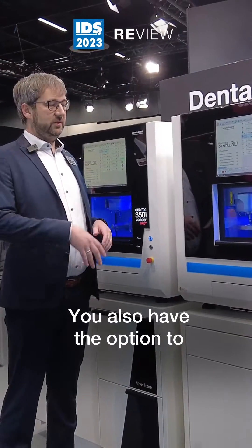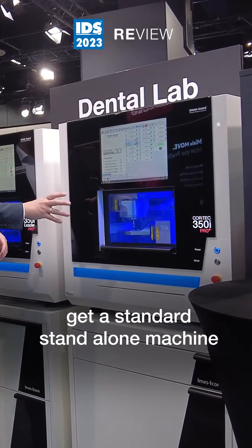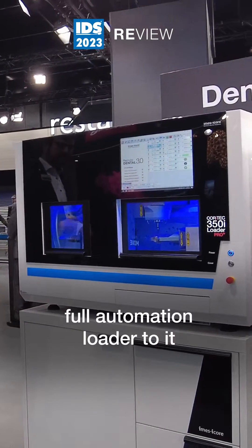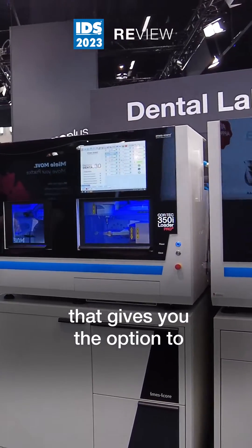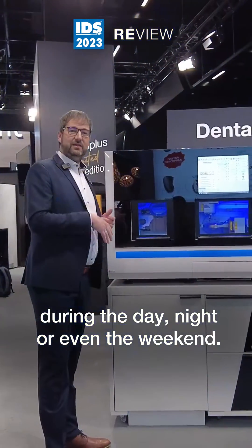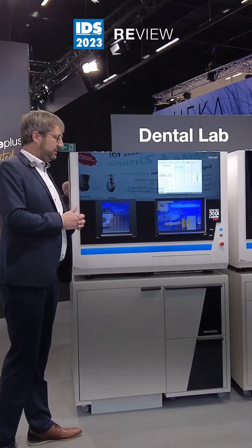You also have the option to get a standard standalone machine or add up to a 12x full automation loader to it. It gives you the option to mill automatically and rechange the blanks during the day, night, or even the weekend.